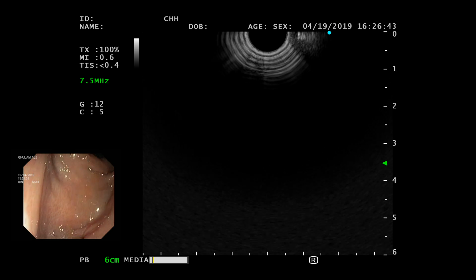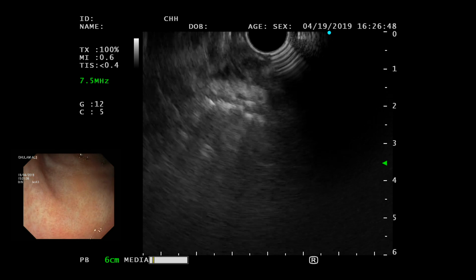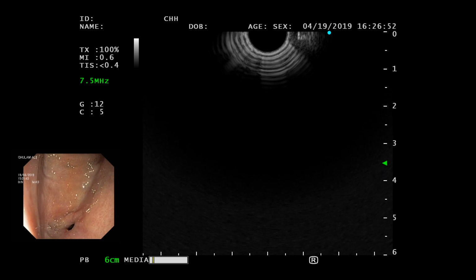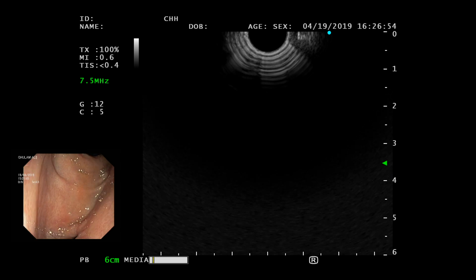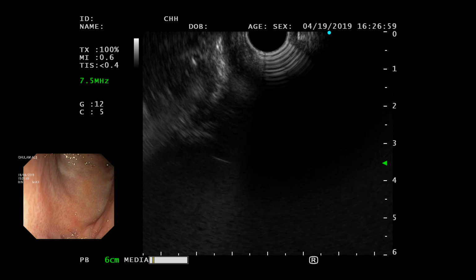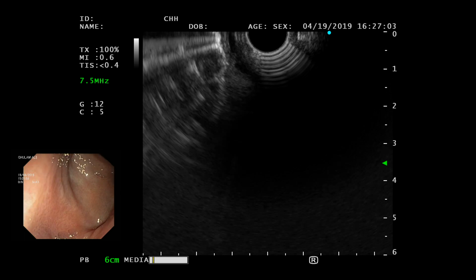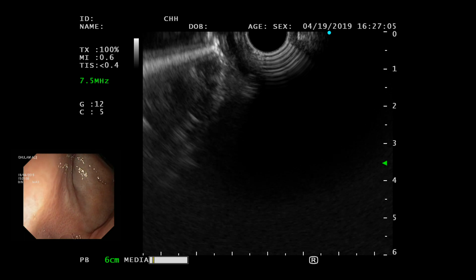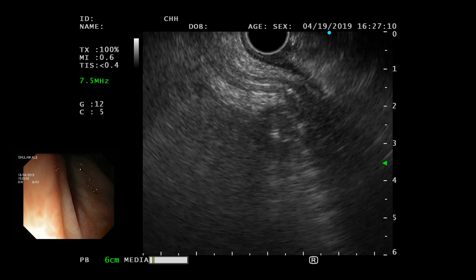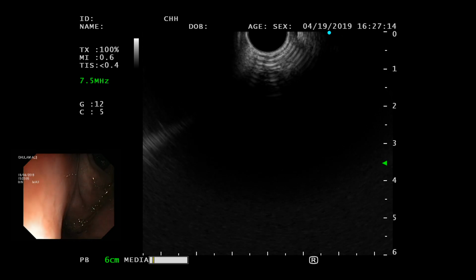Not too much. Okay. Still keep in view a little bit that it's different from the ERCP scope. One minute. Come back. Go in a little bit. Follow that. Okay. Again, go in, stop there, okay? It's trying to run away from you this way, okay? So just a little bit, small wheel away from you and then advance it, okay? You passed it, so you need to come back, okay? And you have to somehow dip in there now, go in.